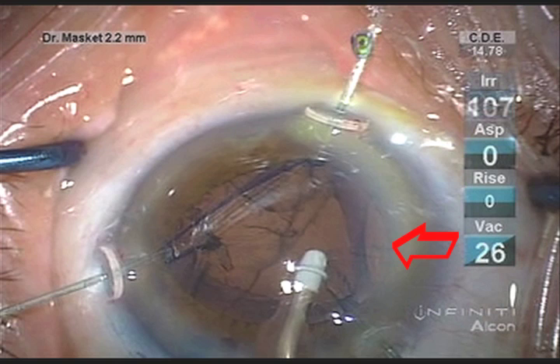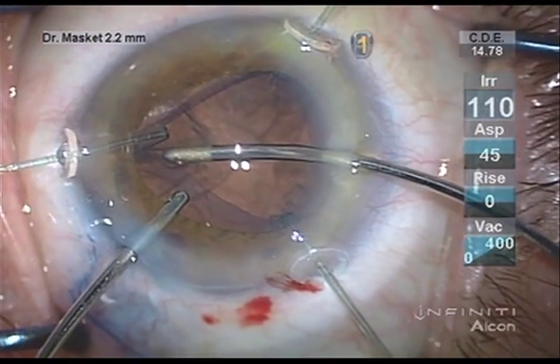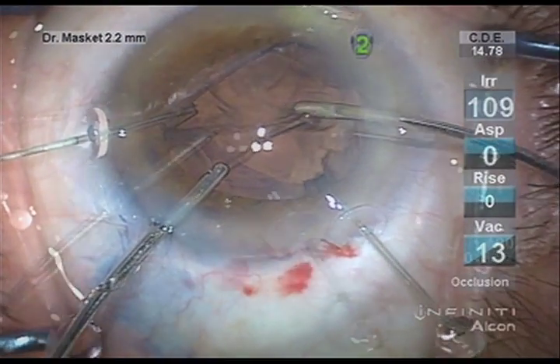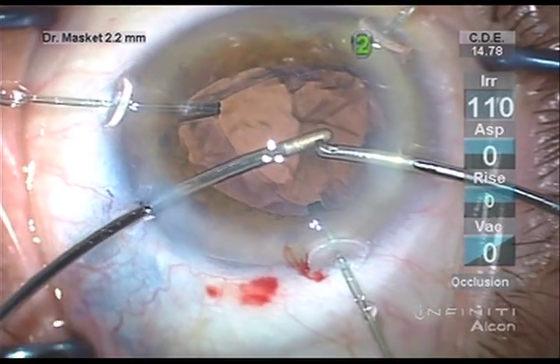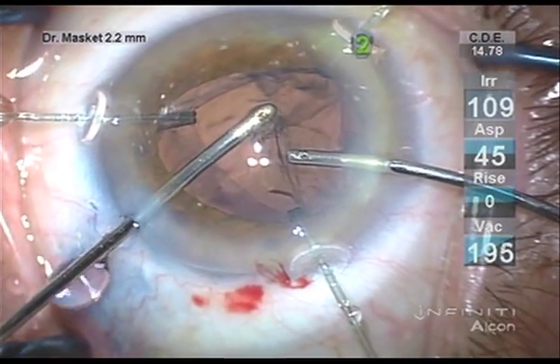The arrow indicates the area of zonule dehiscence inferiorly. The view is further enhanced by the trypan blue staining of the anterior capsule. Additional paracenteses were made so that I could use bimanual cortical aspiration. I was able to remove all the cortex in bimanual fashion using additional viscoelastic and hydrodissection to both expand the capsule bag and separate the cortex from the capsule.